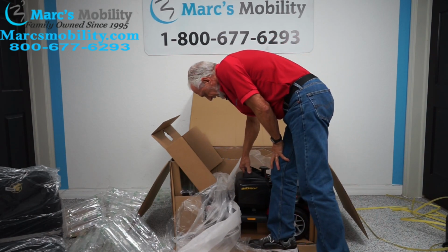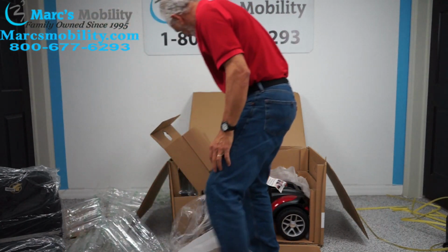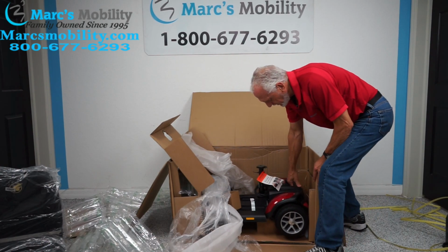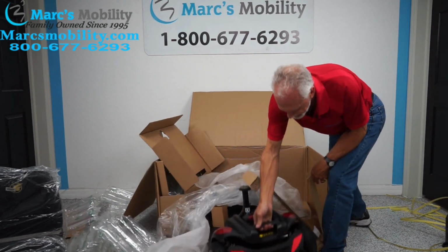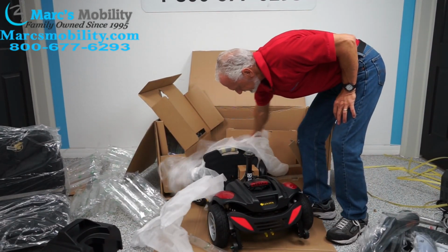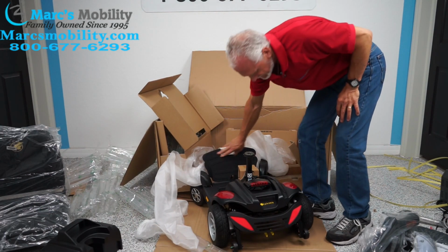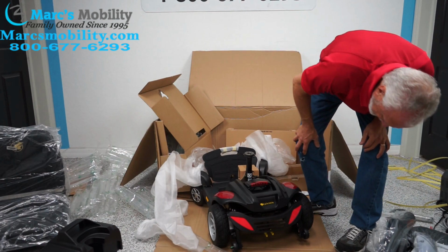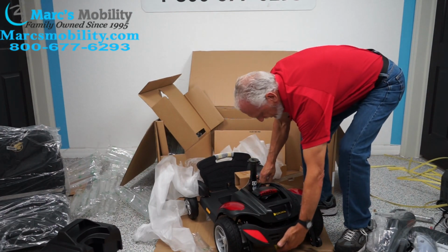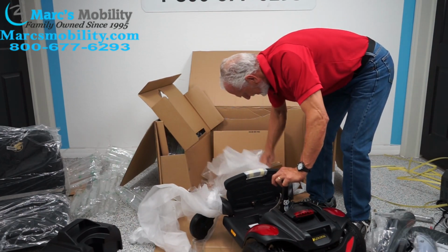There's the battery pack. I'm going to pull the battery pack out to make it easier for a second. Pull the battery pack out. And what I'm going to do now, I'm just going to pull the butt of the chair out like this. Pull it out of the box. So while we have the chair out of the box, I'm going to put it in neutral. There's two levers right there right under here, so you can roll it. I just want to get it out of the way so I can get my box out of the way.